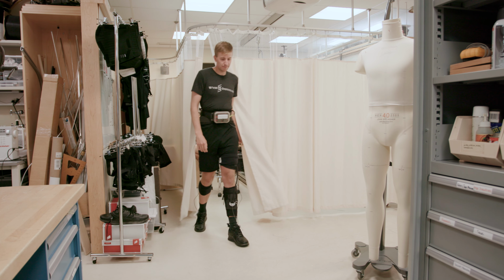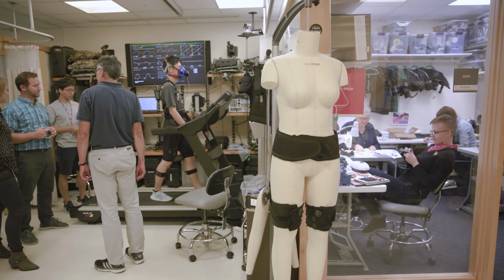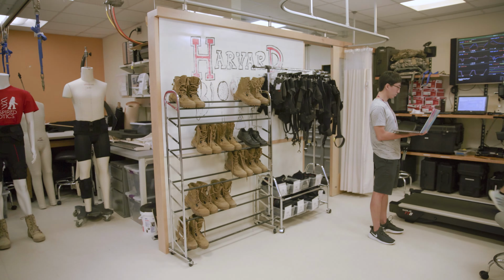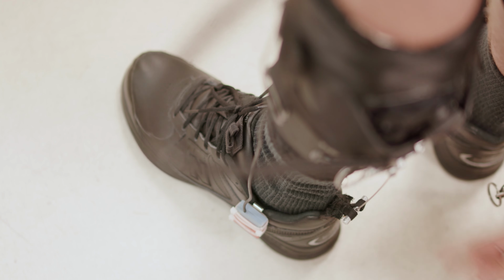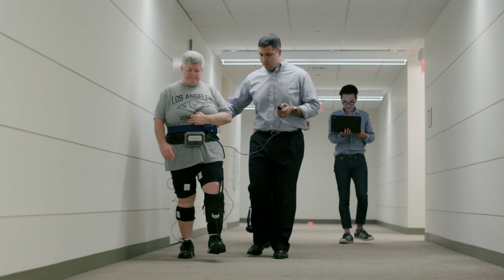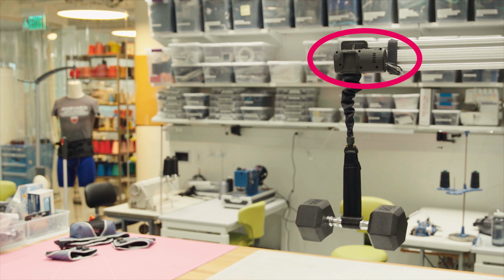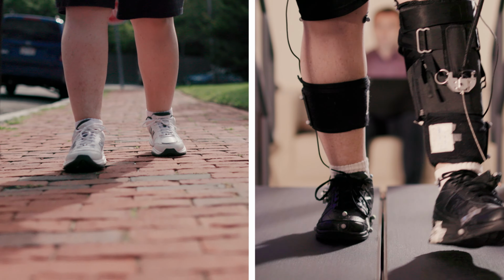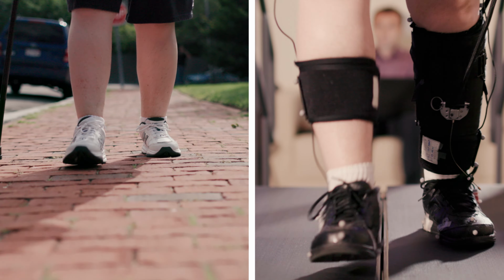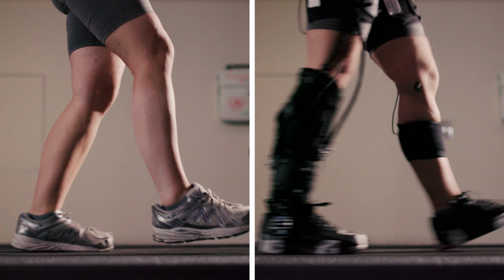Approaching the problem of reduced mobility from a completely different direction, a Wyss soft robotics team designed a light and flexible soft exosuit made of clothing-like fabrics and Velcro that wrap around the legs of stroke patients. By applying mechanical forces to the patient's joints at precisely the right time during walking, these soft exosuits improve the natural mechanics of the human body to help restore the ability to walk.